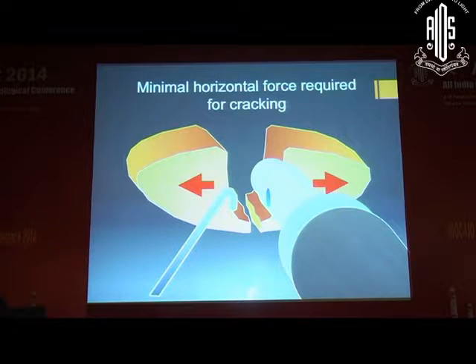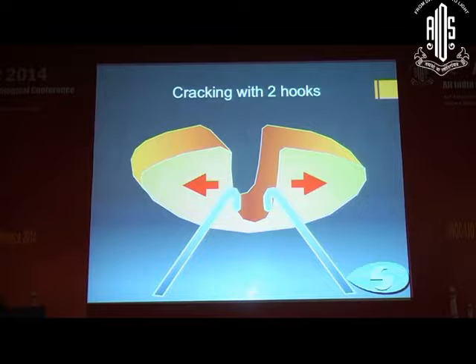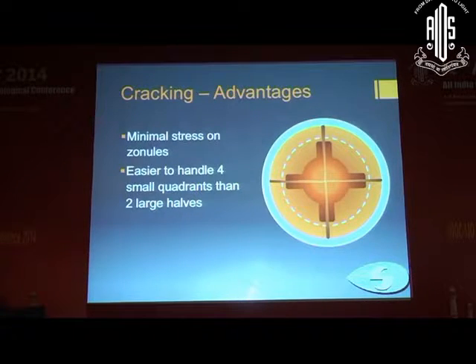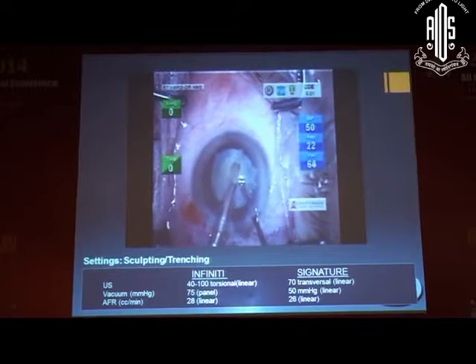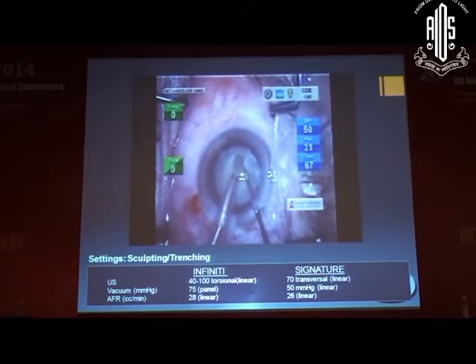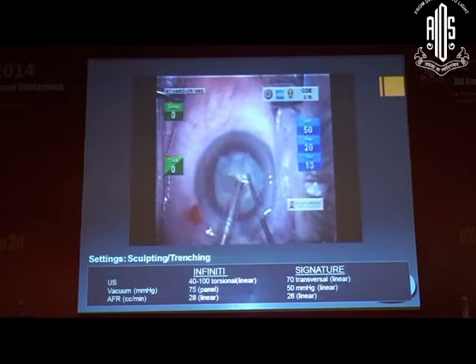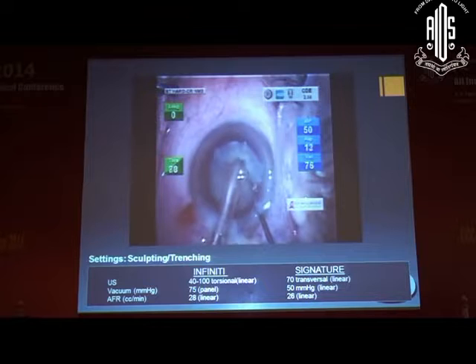When you are trying to crack, a minimum of horizontal force should be required. You can do it with two instruments — the phaco tip and a second instrument — or with two hooks. The caution is that the two hooks should be placed deep inside, not superficial, so that you can do a successful crack. You should sculpt from the center toward the periphery and ensure there is no central island, as that will prevent cracking all the way to the center of the nucleus, which is essential.